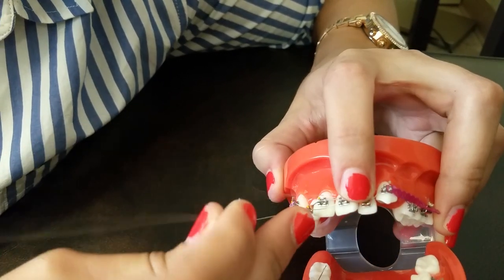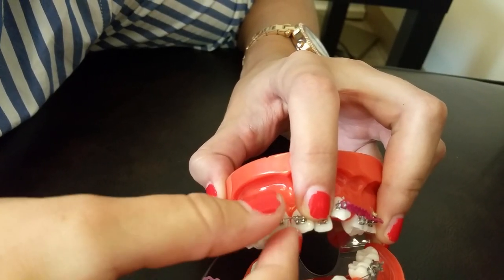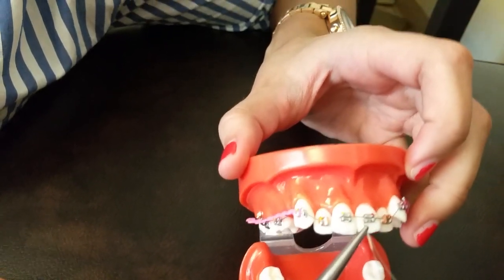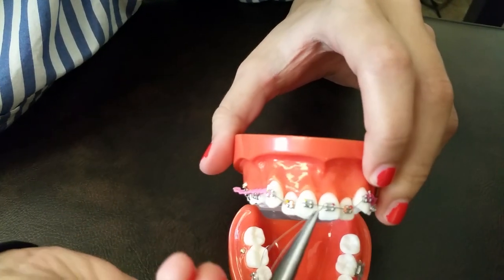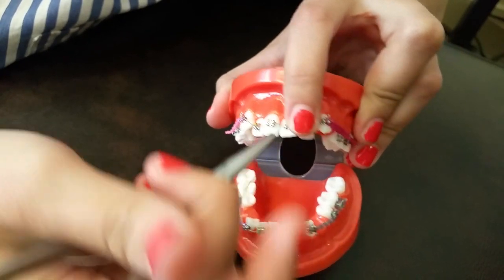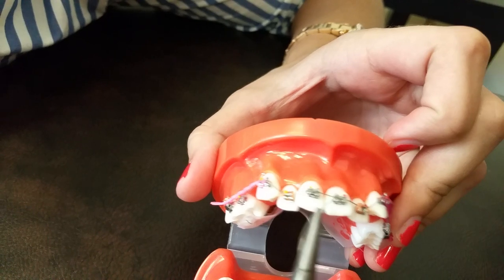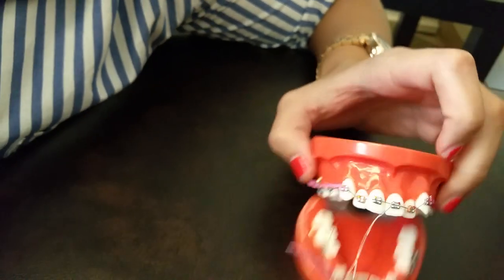Make it snug, make sure it's under all four corners, and then you want to twist a couple times so it stays in place. Grab your tool, make sure you have both ends of the stainless steel wire. Hold the ends with your hand so they don't fly into the patient's eyes, and twist until you see it tighten. When you're on a patient, if you see their head shake a little, you know you're good.